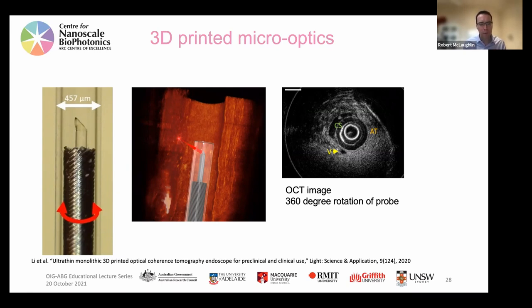There are some people who've done some work on whether I can make tissue more transparent, a thing called optical clearing, which is a decent approach, but also not necessarily feasible if you're deep inside someone's body. You can't put in extra chemicals to make it clearer. And that's why our focus has really been, okay, we can't see further than about 1 or 2 millimeters in OCT. What we can do is get closer to the thing we want to see. And that's why we will put our probe into a needle and stab it in and take it right up to the area we want to image.